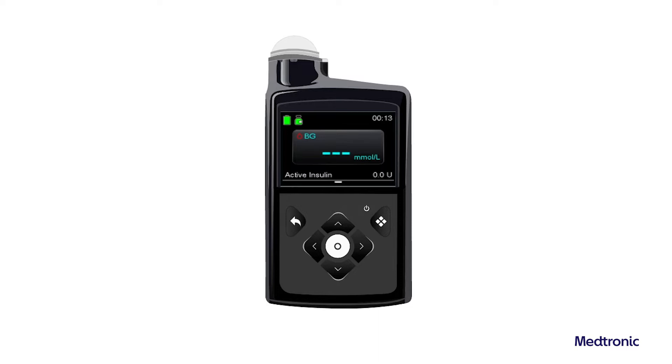After the temp basal rate delivery is completed or cancelled, the programmed basal pattern resumes.